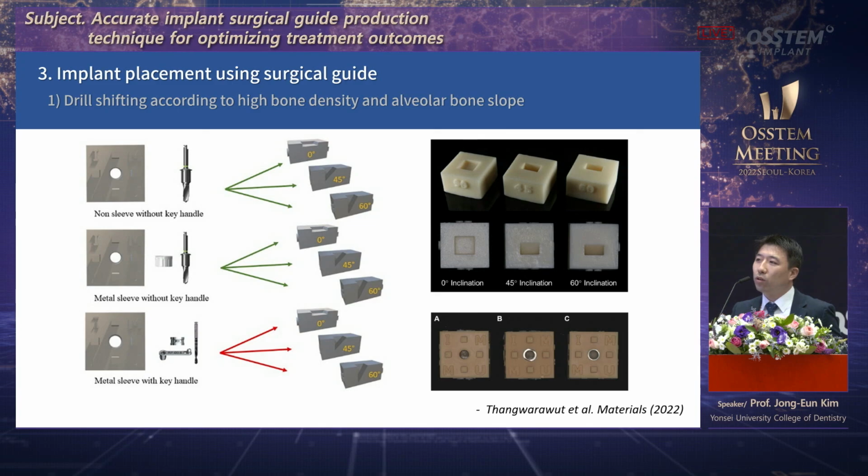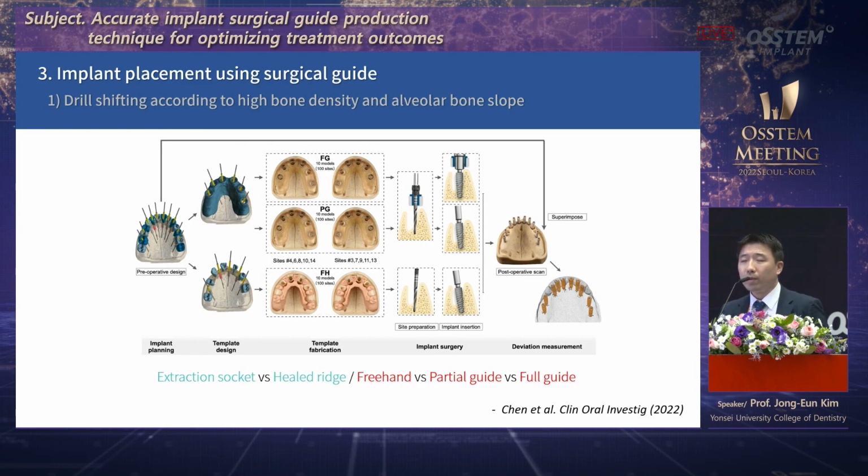At times, there are slopes in the desired implant placement site, and when we apply drilling, we cannot do the drilling as planned, but at times there can be drill shifting. We need to remember that. This is very true in immediate placement.